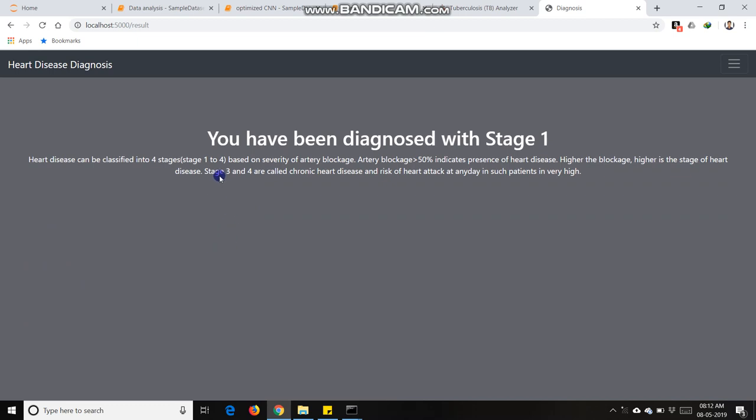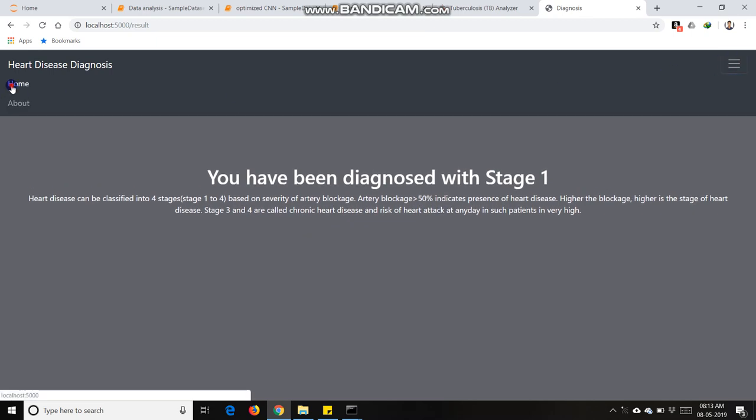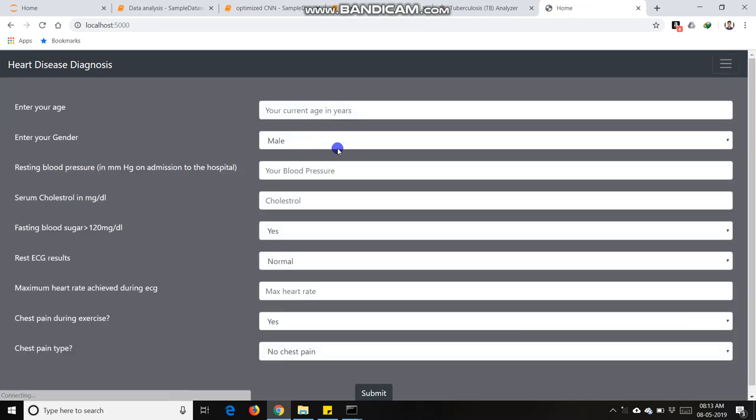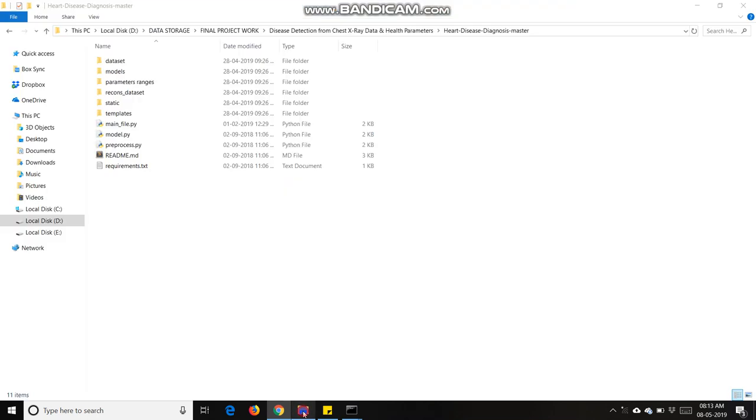It predicts the heart disease with stage 1. It's showing that it's just beginning of the heart disease. It predicts up to four stages and also predicts that person is normal or not. It's made in Flask technology. Okay, thank you.